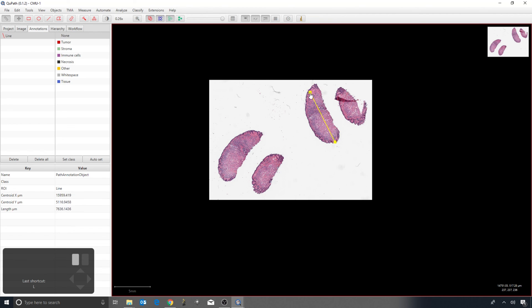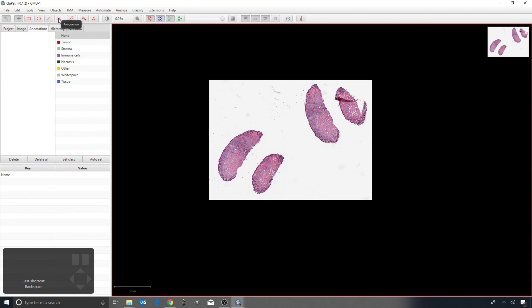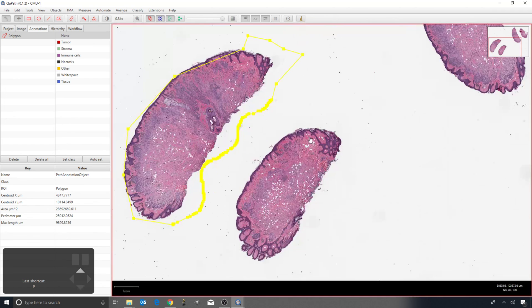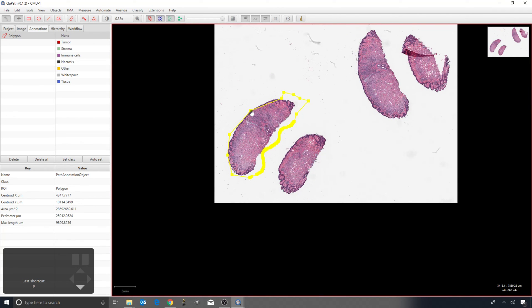If that pixel size information is missing, you'd only get the line length in pixels. Press backspace to delete it. Moving on to the polygon tool — shortcut P — this lets me click individual points or click and drag for more detail, then double-click for the last point to complete the polygon. I can then click on points and move them if needed. Using individual spaced-out clicks makes modification easier afterwards; click-and-drag creates many handles and is harder to adjust.